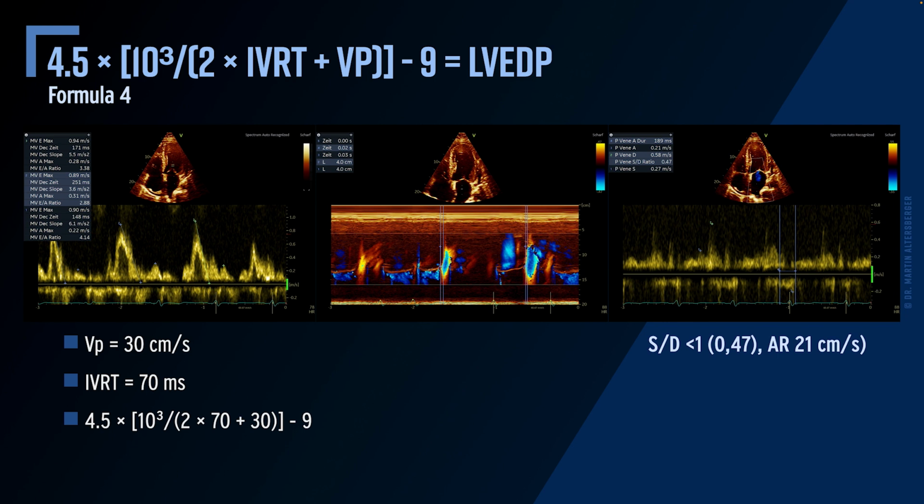And with this formula, we have now the numbers inside, and one quick word on the measurement of the pulmonary venous system. So we also can measure the pulmonary veins. So here you have an example where you see this patient, the left ventricle, the left atrium, and the pulse wave Doppler, we have to make the sample volume a bit smaller, so it should be 2 to 3 millimeters. Normally it's around 5 to 8 millimeters.